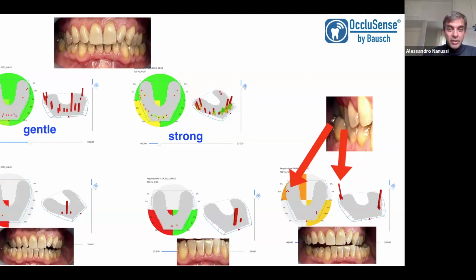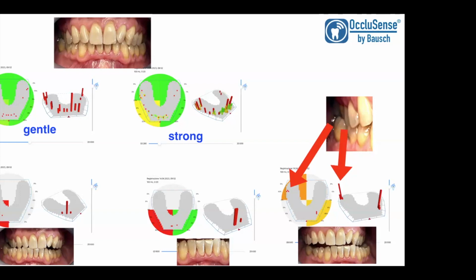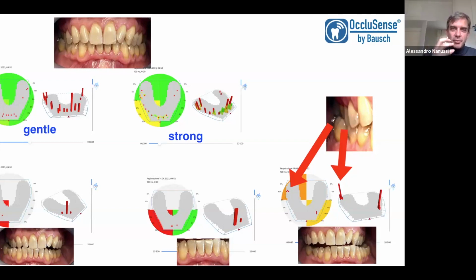And about the anterior overload, yes, when he exerts an anterior load, he exerts an important overload on the two central incisors of the lower arch. So it's a problem of dynamic movement. If you see the load in the usual intercuspation, he doesn't load so much because he has already ground the teeth. So they are at this time in a static position, not so much overloaded. But in anterior movement, yes, they are. This is important to know because some patients sometimes have this evidence that creates an important overload because the jaw tries to stay in protrusion.